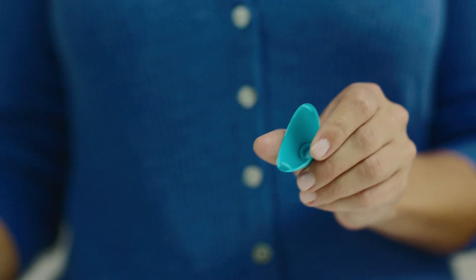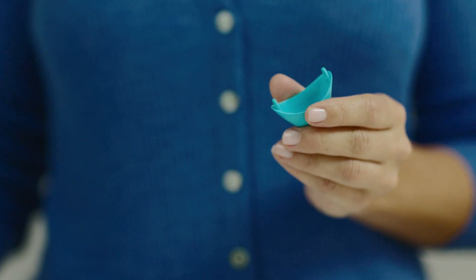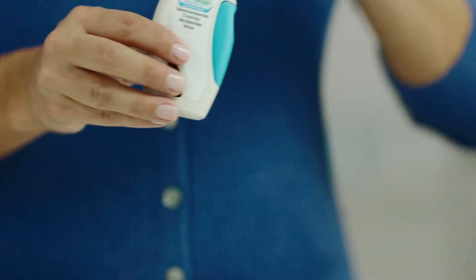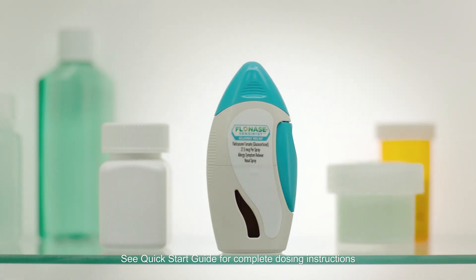And once a week, make sure to clean the inside of the cap with a clean, dry tissue. This helps keep the nozzle from getting blocked and helps make sure you get a full dose of once daily Flonase Sensimist. Now that your nozzle and cap are clean, your Flonase Sensimist Allergy Relief is ready for your next dose.